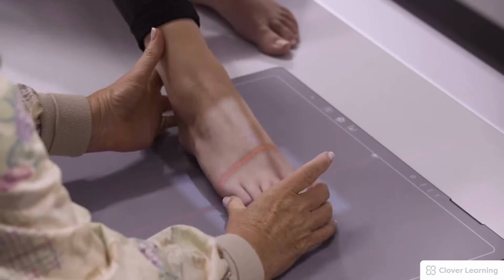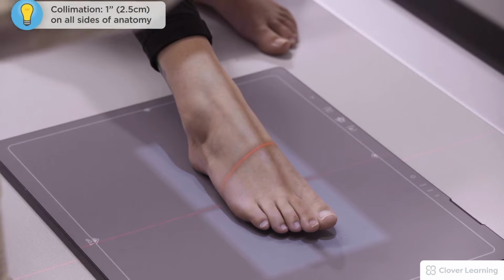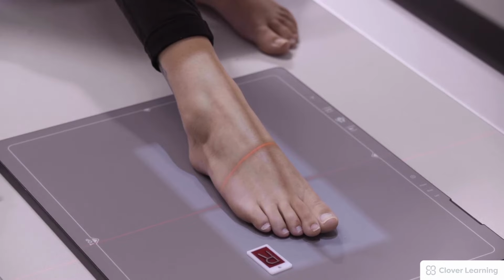Just get your foot forward just a little bit. We're going to open this collimation up. So 1 inch on either side, making sure you see the shadow of all the digits. Placing a right marker. The patient will hold very still and the exposure is taken.